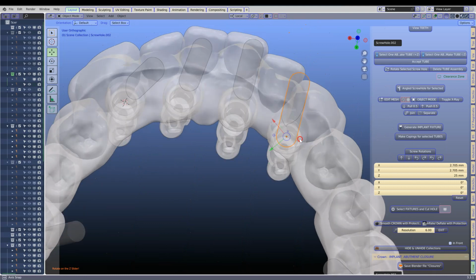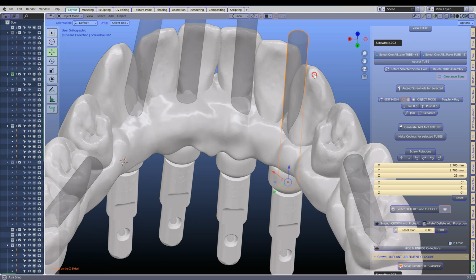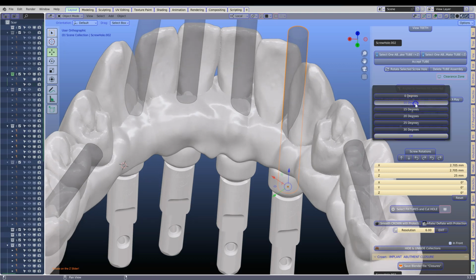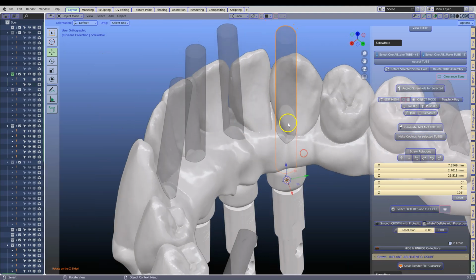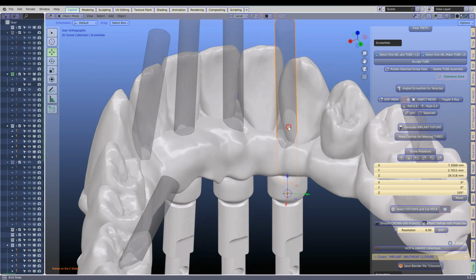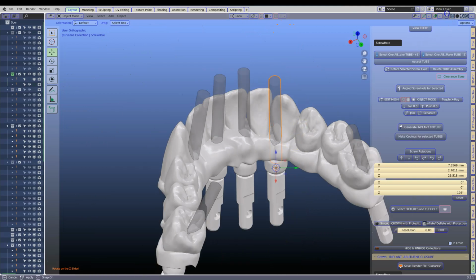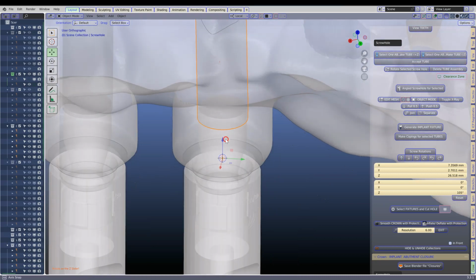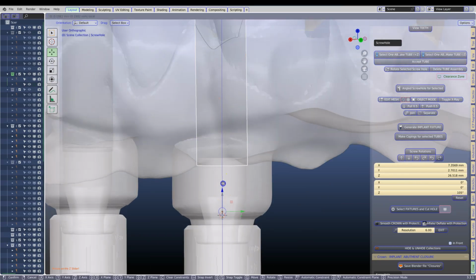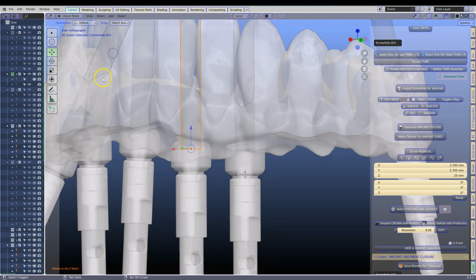Now here, on this one, we may also want to consider an angle because of where it comes out. So let's grab a 10 degree angle, click on OK, and move the slider. So here again, I'm moving it so that I can get a good path where the screw hole is. Again, we're going to adjust these to make sure that they are in the correct position to make a hole. So these are all good.